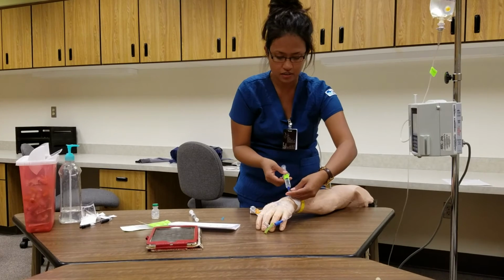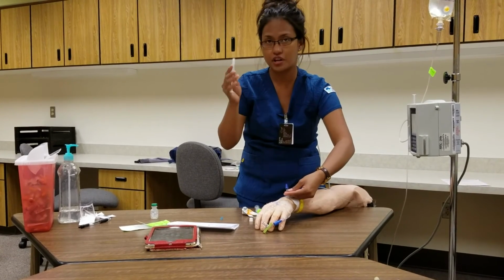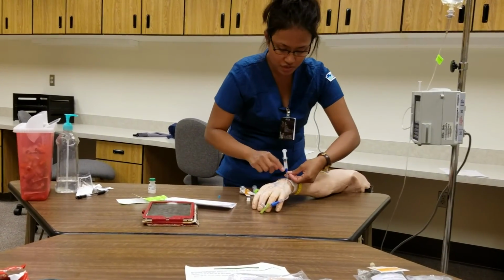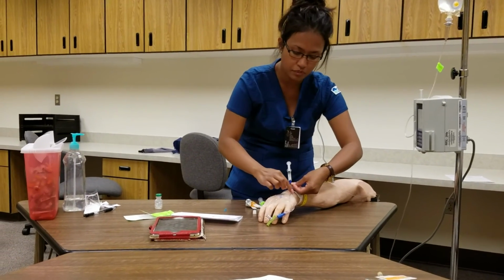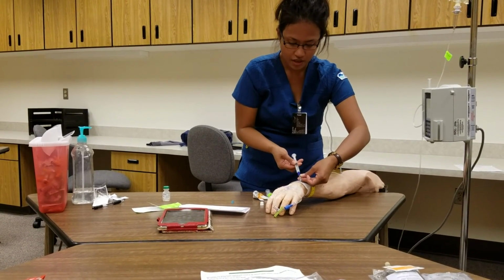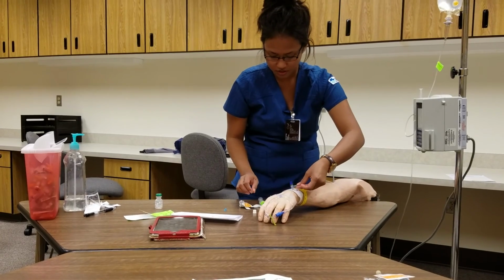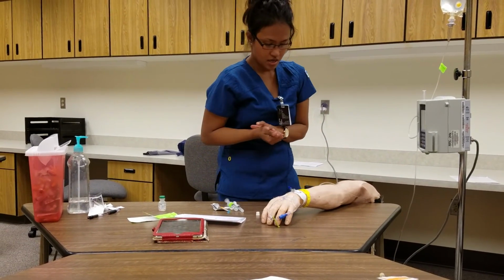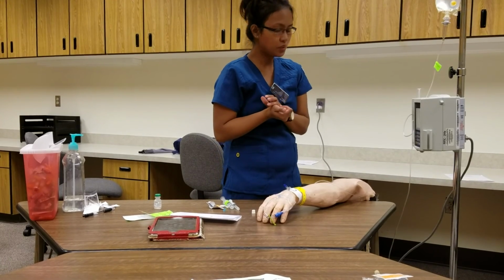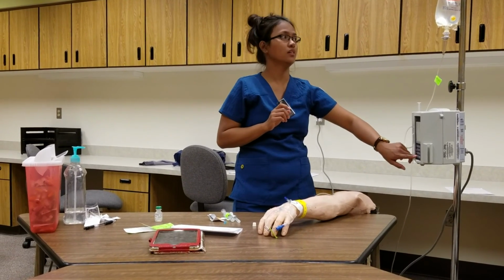After infusing that, I will be flushing with 3 ml normal saline. The purpose of flushing is to make sure that the medication goes all the way into my patient's vein, because some may be stuck here. So flushing looks good. Make sure it's okay. Alright, so discard all the things that I've used, and I am continuously assessing my patient's skin and the site. After doing that, I'll document and start the primary bag again.